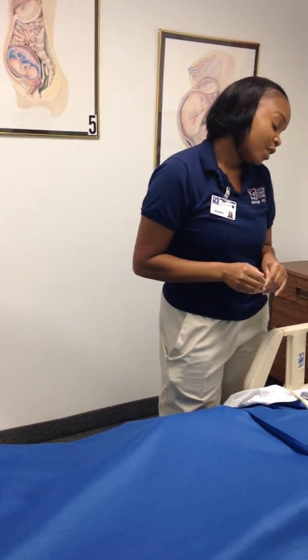I'll go ahead and wash my hands. I'll open up the curtains. Is there anything else I can get for you, Miss Jones, before I leave? No. Okay. Once I'm finished, I'll make sure I document and we're done. Thank you.